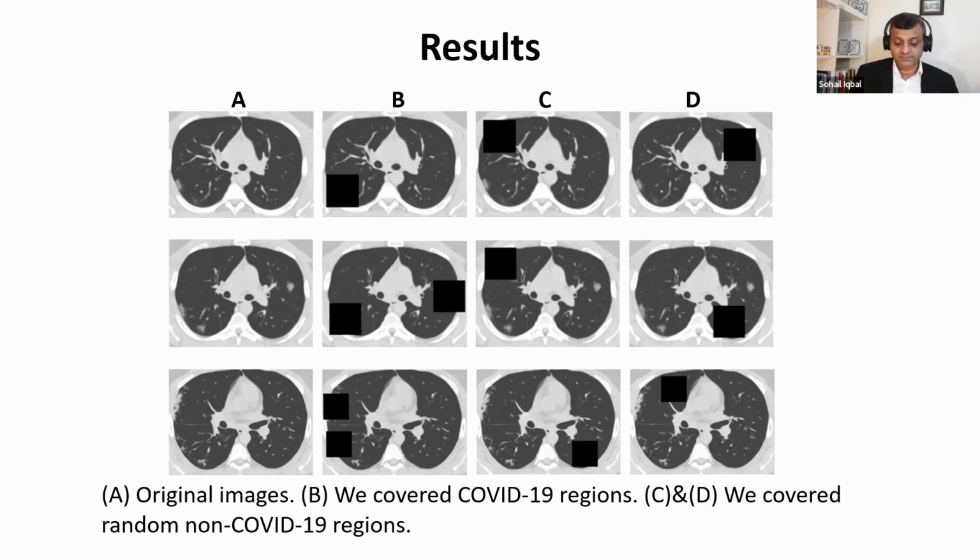There are many papers, and I can send you the link, where they find the topologically important regions and find their inverse images in the representative cycles, and from those cycles you can try to find the important regions in the image. So that's done so far, but segmentation just from the topological approach, I have not seen it. I have not done it.